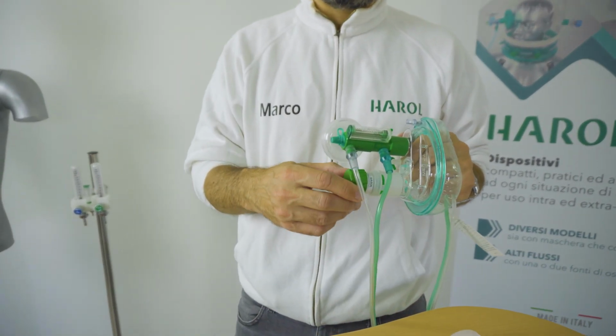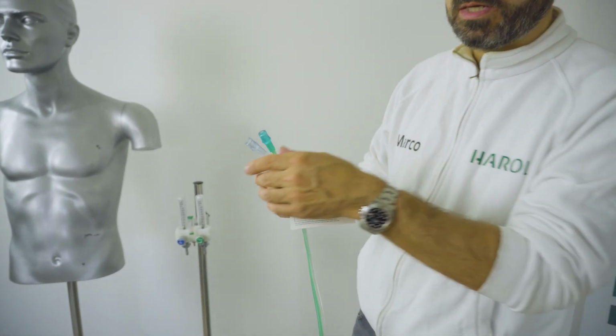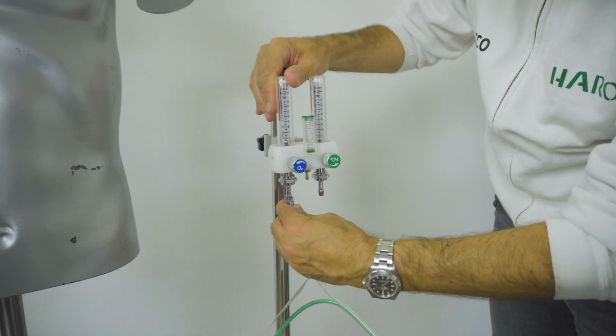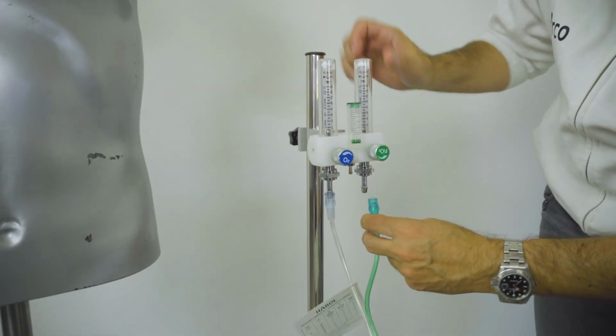Open the PEEP valve and connect the two lines to the flow meter. Open at around 10 liters per minute. Apply the mask on the patient and wait a few minutes for them to adapt. Then, attach the mask. Set the PEEP by controlling the valve and by checking the value on the integrated pressure gauge.